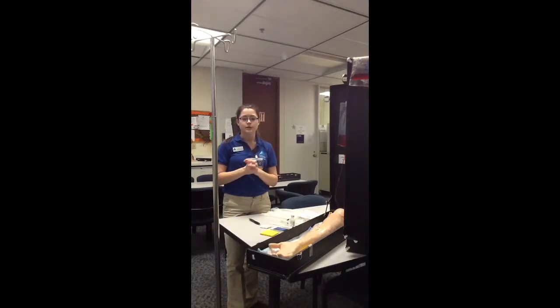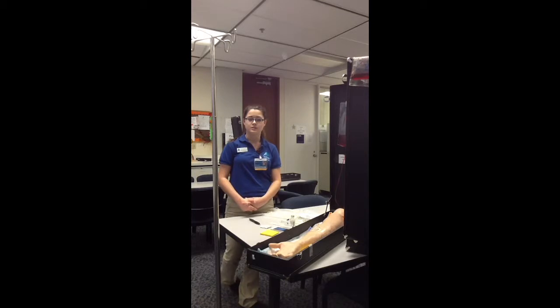Alright, so now I'm going to do my IV minibag, and first I'm going to implement my standard protocol and make sure that I have the correct medication, the correct dosage, the correct route, and the correct frequency. And the doctor ordered for Miss Jones vancomycin, and I would check my drug and make sure that I know the action, the purpose, the dosage, side effects, contraindications, infusion time, and the implications.